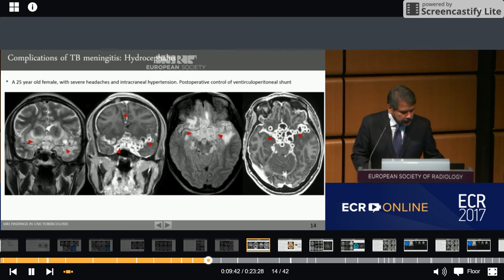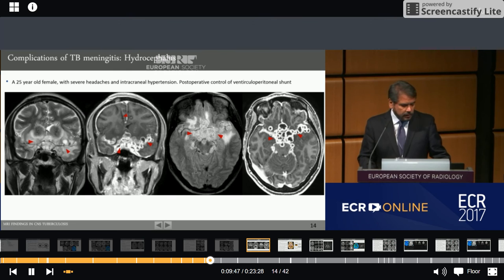This is a 25-year-old woman with severe headaches and signs of intracranial hypertension. Here, we are showing the postoperative control of a ventriculoperitoneal shunt. Hyperintense signal on the axial FLAIR images and enhancement on post-contrast imaging.